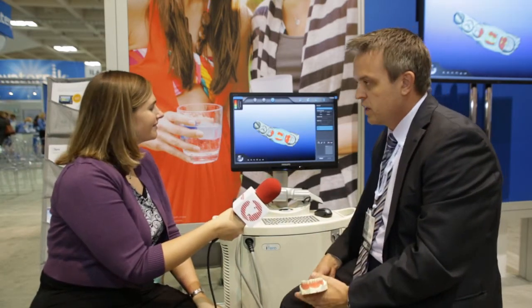Now what can you tell us about the scan? I see it just finished while we were talking. Well, in real time it will show me the occlusal clearance I have against the opposing tooth. So if I want to make a change right now, I can do that. I can erase off a portion of the preparation, then rescan just that one section after making a change — which is a really nice feature. I can also zoom in on the margins and make sure I have a nice, clean margin. It enables me to have a real-time, exact replica of what's in the mouth.